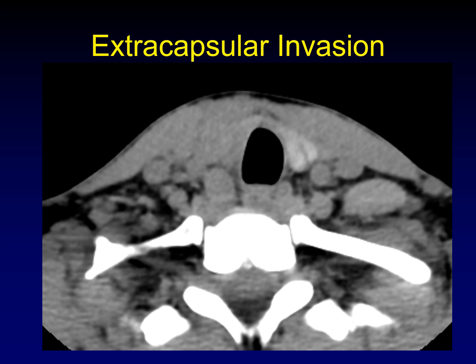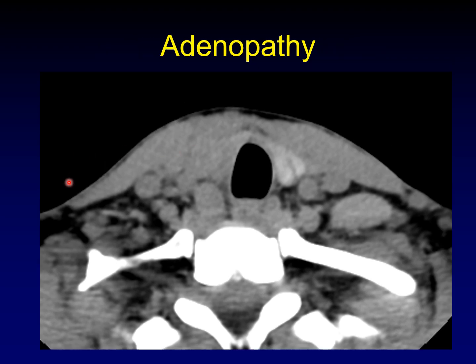Here's another example of extracapsular invasion showing the loss of fat planes all the way around the thyroid mass. Shifting to talk about adenopathy — there is actually a central compartment lymph node right behind the thyroid gland. It's a discrete mass. When I say central compartment, I mean it's between the medial edges of the common carotid arteries. So that's central compartment adenopathy.